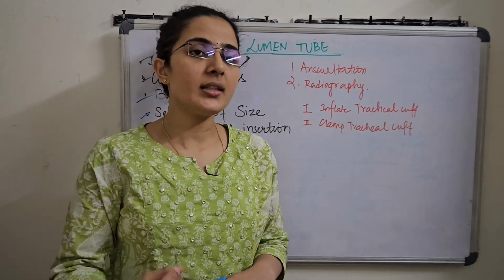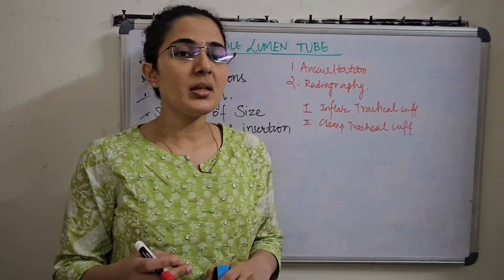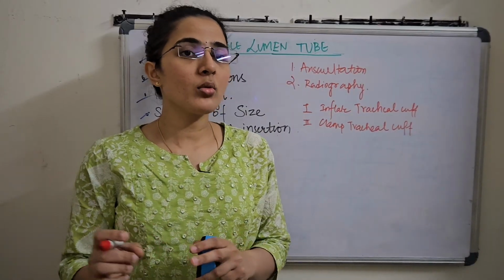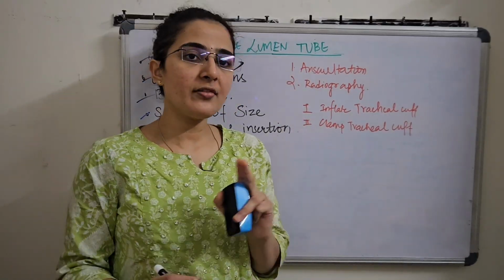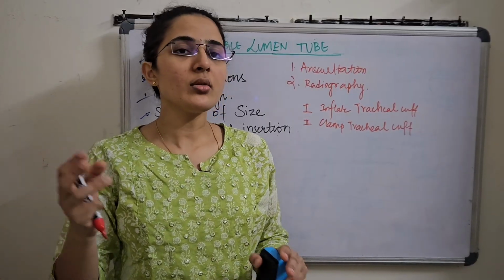Right, so once you inflate the bronchial cuff, we have to ensure that peak airway pressure doesn't increase too much. Maximum allowable will be a peak pressure of about 40. Right, and also usually it shouldn't rise more than 10 above our baseline 2-lung ventilation. Okay, so once you inflate the bronchial cuff, you clamp the tracheal cuff and proximally open and vent it to the atmosphere.